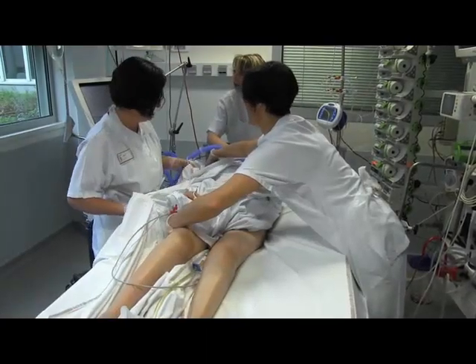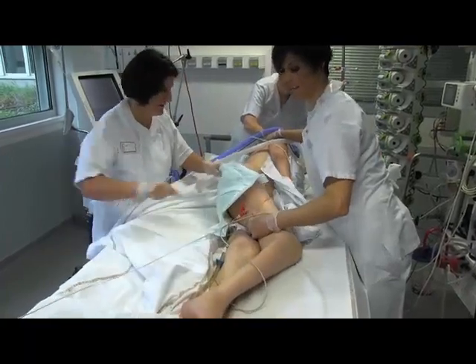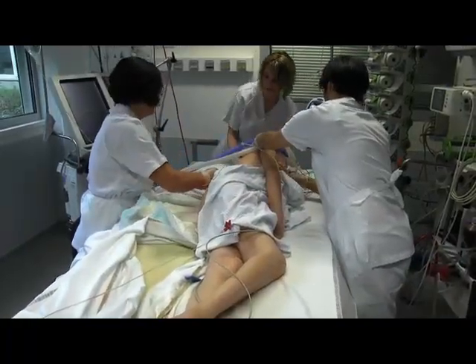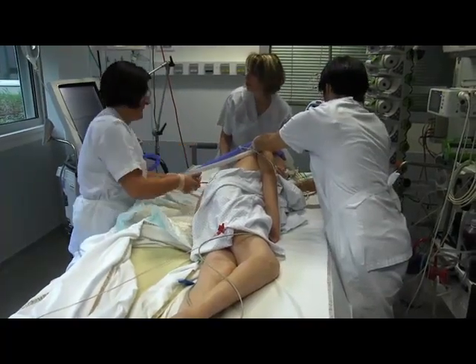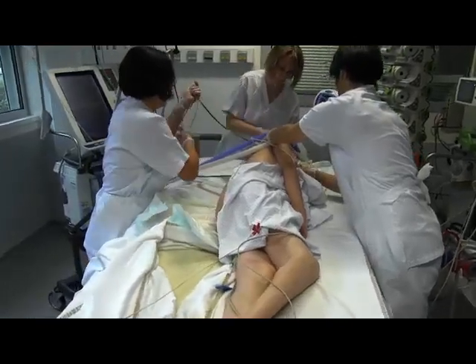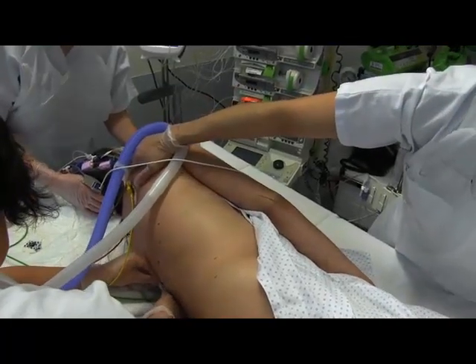The third step is a side lie. The patient is rotated laterally into a full side-lying position. The patient is maintained in this position for a short time while one person removes the electrodes from the anterior thorax and another person attaches the new electrodes to the back.